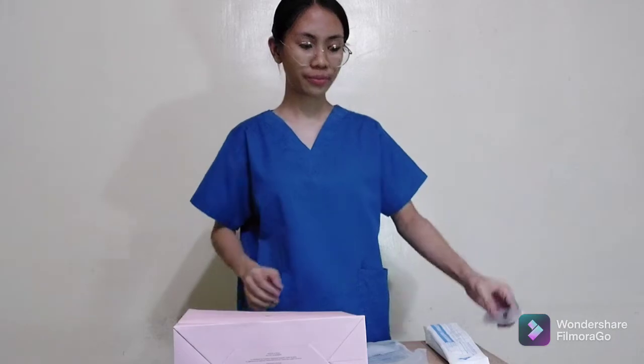Here are the catheter supplies: the catheterization kit, the urinary bag, the Foley catheter, and the prefilled syringe.